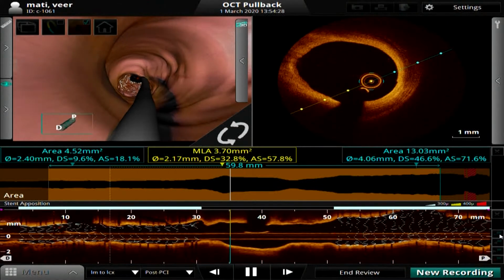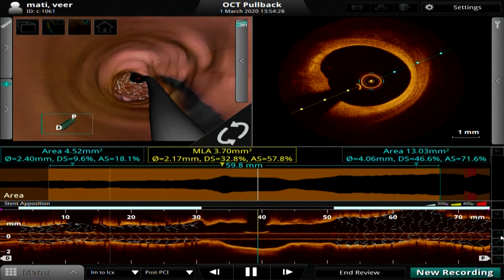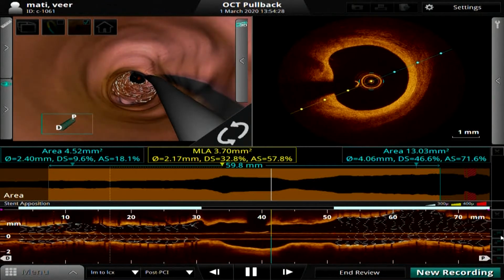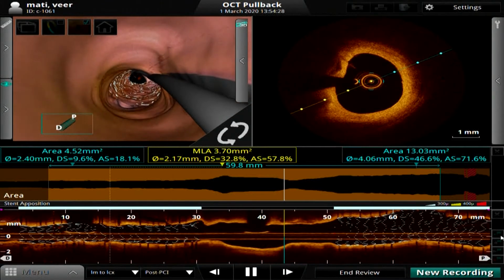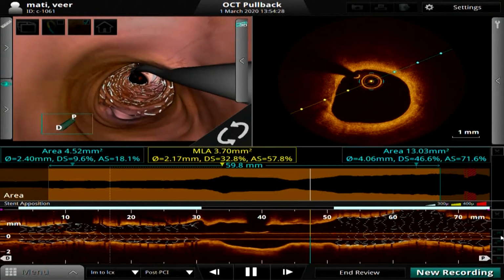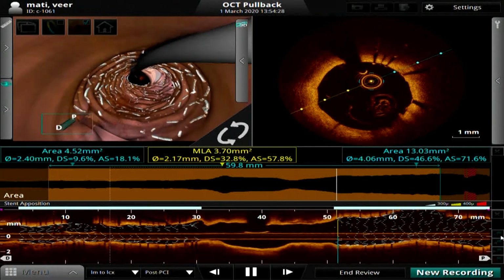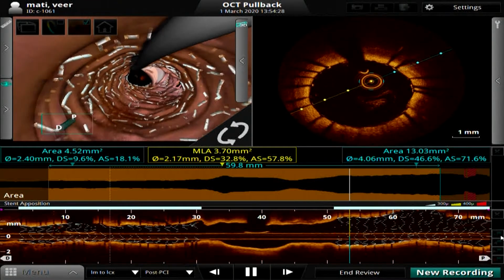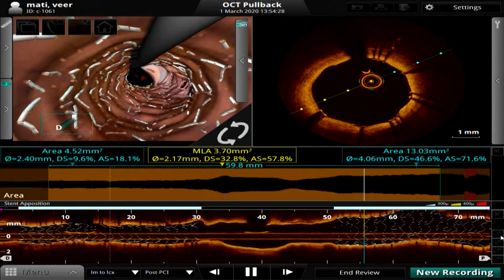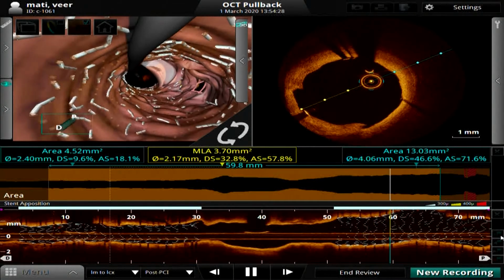And this is about the left main. At 9 o'clock, you can see some plaque is there. Calcification at 9 o'clock. And right, this is the left main stent, non-critical, well opposed, post-dilated with a 4.5 millimeter balloon, well opposed.